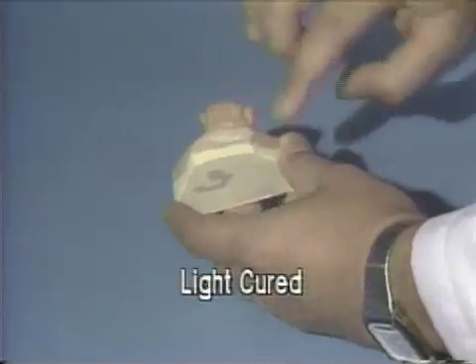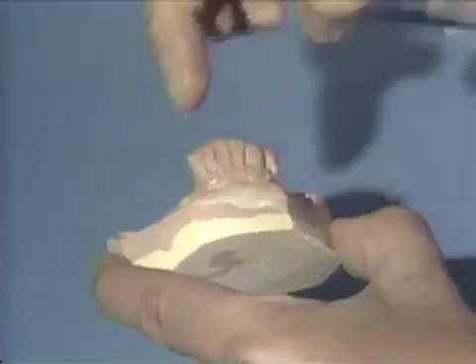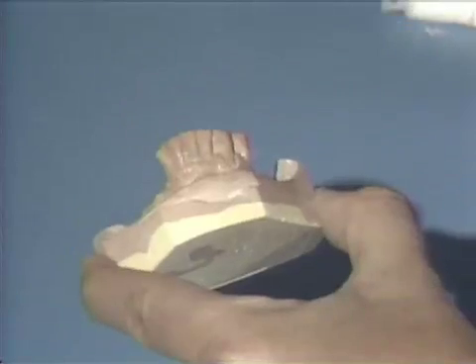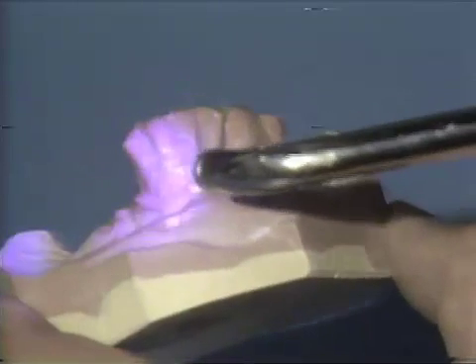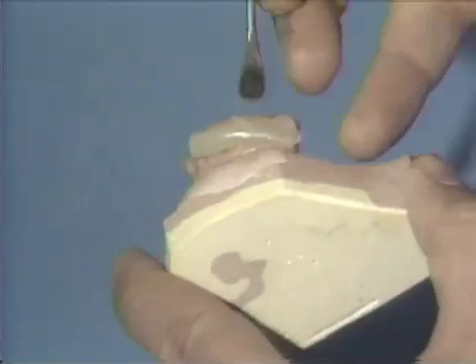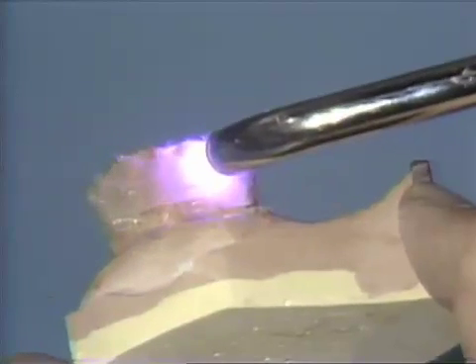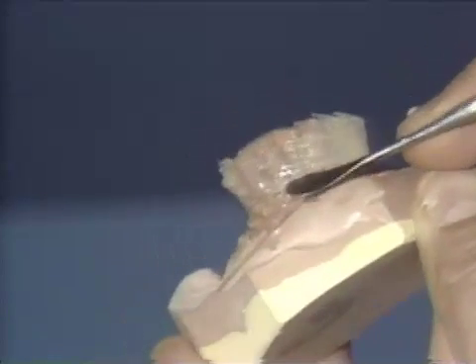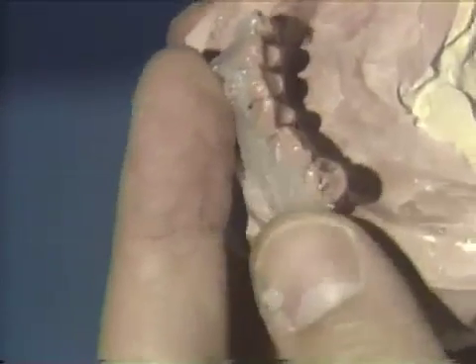In forming the light-cured matrix, the cast is lightly coated with Vaseline to help ensure removal of the matrix after light curing. Any excess Vaseline is removed. A thin layer of occlusal matrix material is placed and adapted well. Using the largest diameter light curing wand available, the material is cured for 30 seconds per area. For ease of handling and rigidity, a second layer of matrix material is added and cured for 60 seconds per area. The matrix is teased off the cast and checked for accuracy. If voids are present, material may be added and cured back on the model. This view shows the sharp detail produced inside the matrix. The matrix is then checked on the cast for accuracy and proper seating.